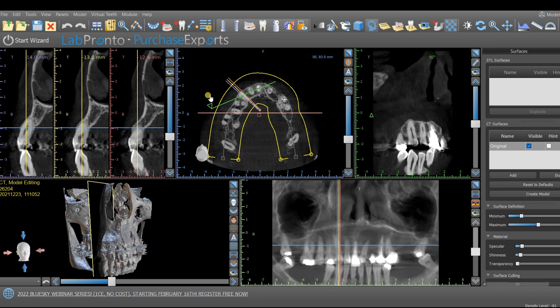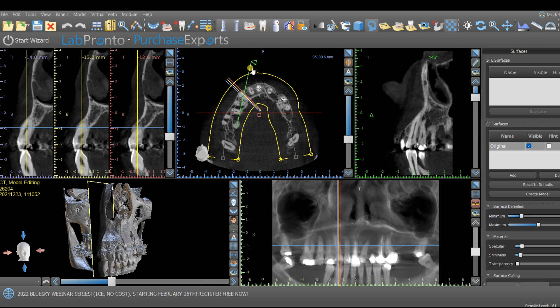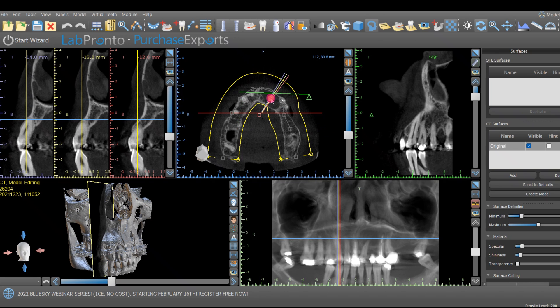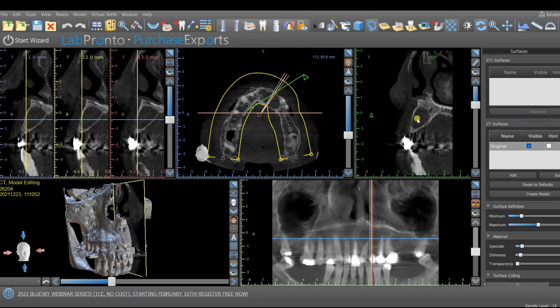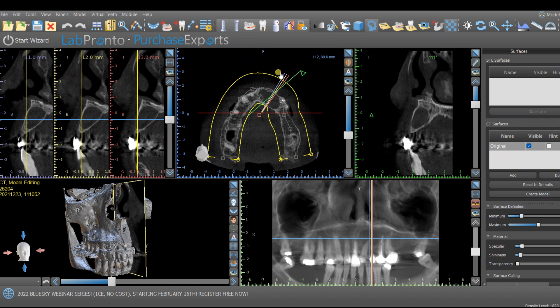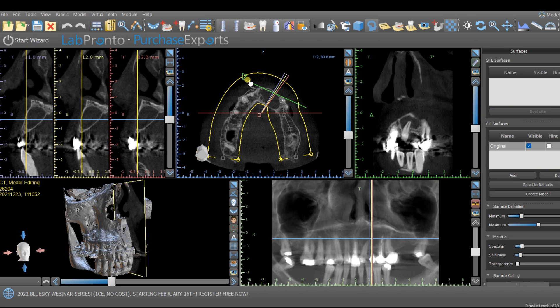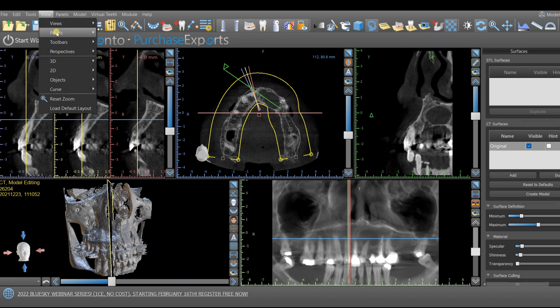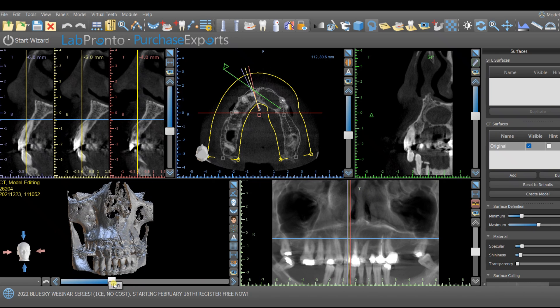It will show us the exact angle of what we are viewing. You can change the angle by grabbing this and rotating it. In this case, there is a radicular cyst — here, we can rotate around it, and you will notice the cyst and the size of it. This is the 360-degree or tangential view. We have inner and outer curve, and you can also manipulate it.